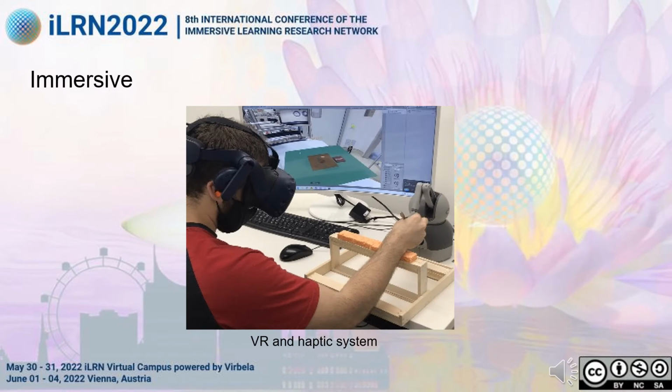In terms of immersion, the system provides a realistic virtual environment through a VR device. A trainee can experience the realistic surgical space with skin tumor image and surgical tools. The haptic device enhances the immersive experience. The surgery process becomes more realistic by providing realistic haptic feedback while proceeding with surgery in the platform. The picture shows the participant experiencing the surgical environment while training the surgery steps.